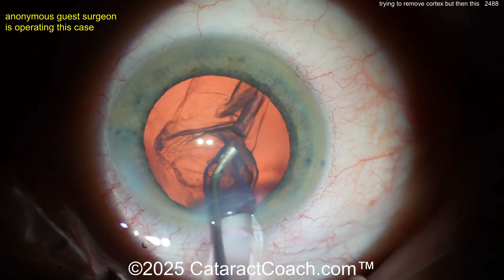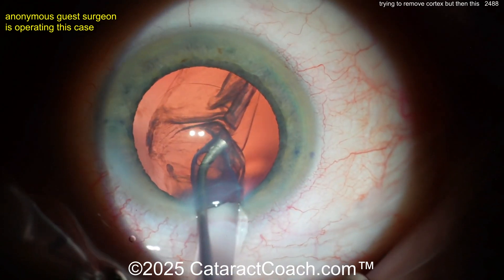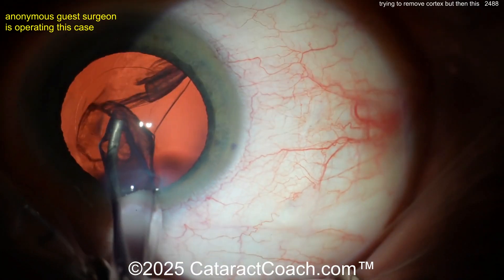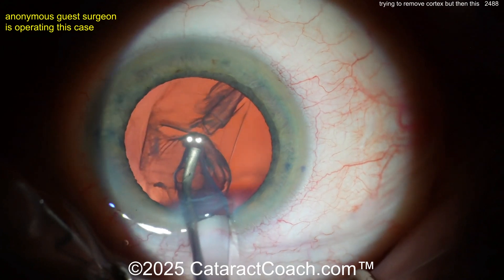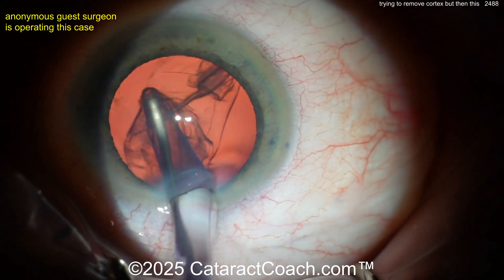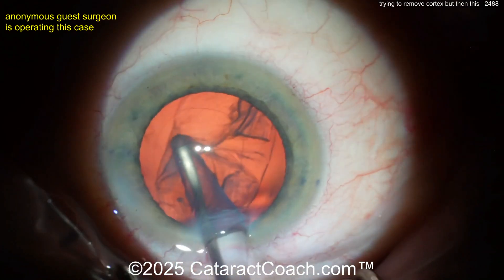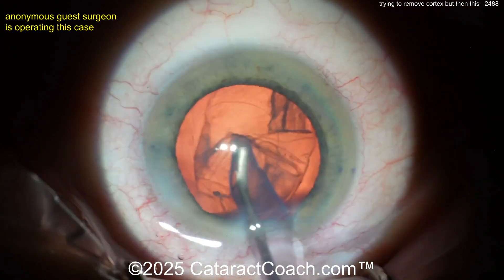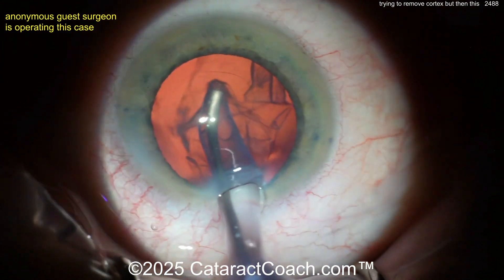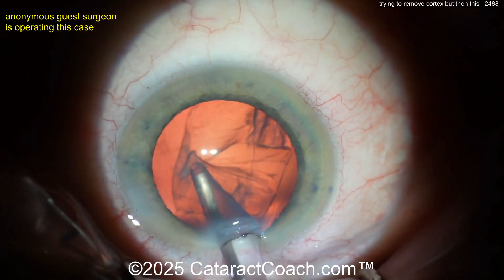Now you've got a huge gap with zero zonular support — at least four clock hours, maybe even five or six. What do you want to do here? If you keep pulling, you're going to induce more and more zonulopathy. What's left of that capsular bag? What are your options? You can keep trying this, but you may also be pulling vitreous coming through that big gap. How are you going to know? Well, that's what triamcinolone is for.